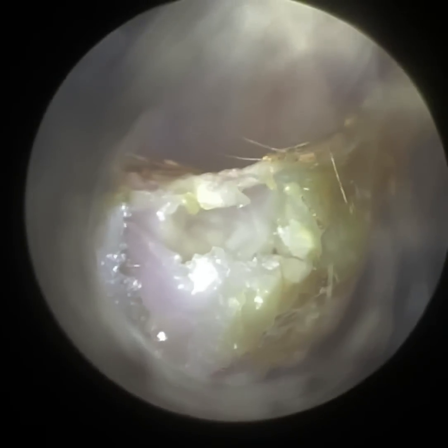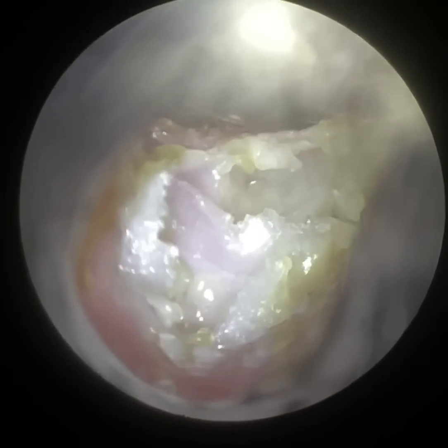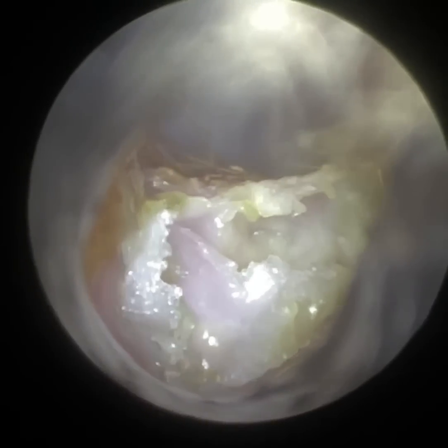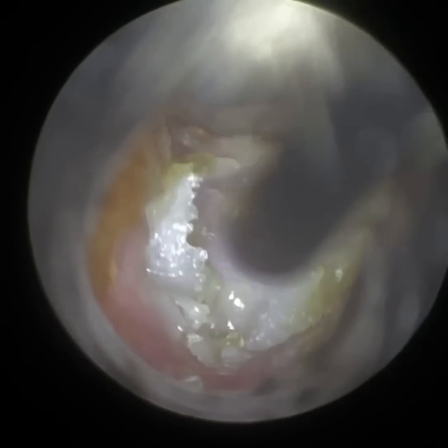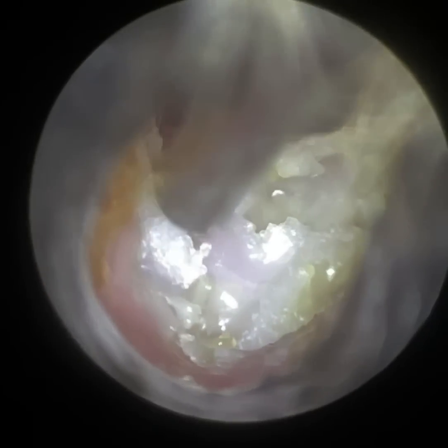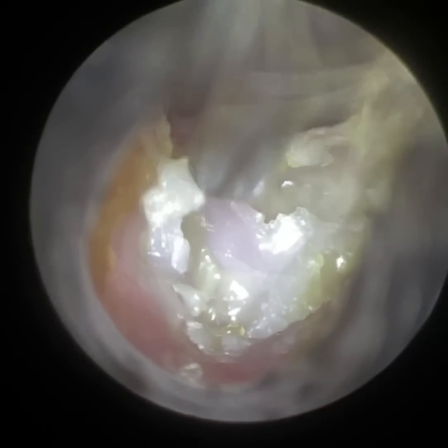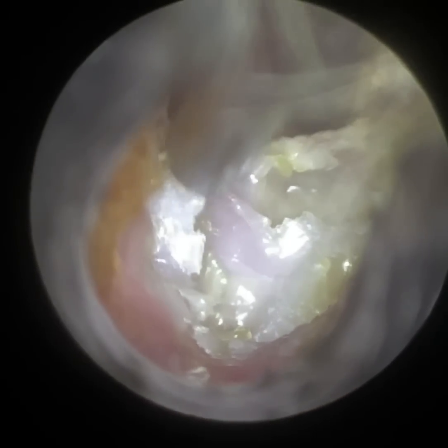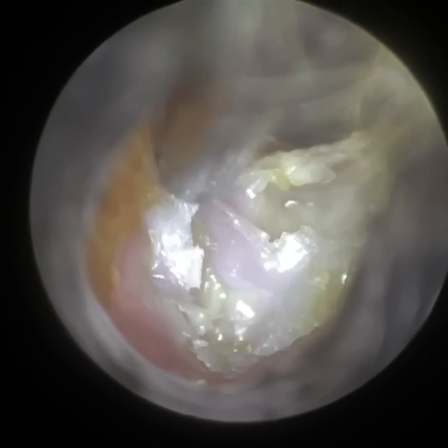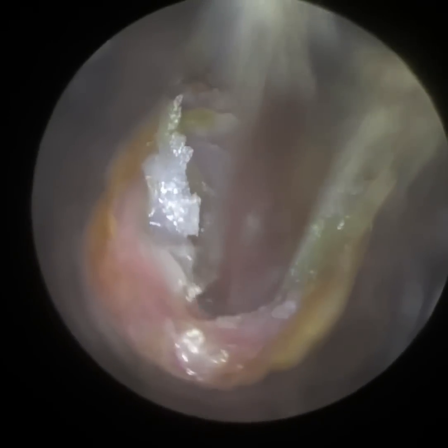I'm clearing the way now. There's a bit of crusted, hardened keratin — there still is a bit around the edge. But you're going to see this dip in the ear canal, this erosion. You can see the bone there — that's exposed bone. We're going to be really careful. When you've got exposed bone like this, it can be really uncomfortable for the patient if you make contact. I don't remove every last speck — it's not always possible with really hardened keratin that's embedded like stone — and that really needs to be seen by ENT.